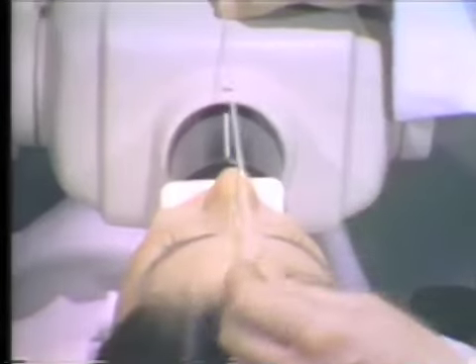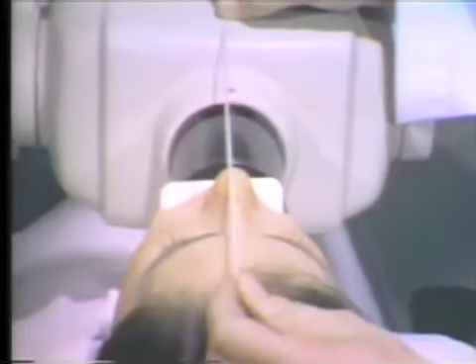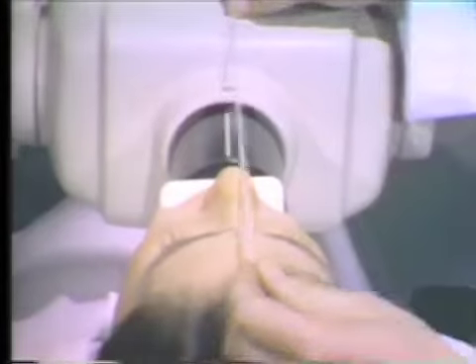With this accomplished, the machine is repositioned so that the central ray will pass along the mid-sagittal plane at a point opposite the first molar area. A taut string may be used to check the position if desired. Viewing from above the patient's head, we are able to ascertain that the central ray is aligned along the mid-sagittal plane of the patient's head. The exposure is then made, and the machine may be moved away. The film is carefully retrieved, and the patient is ready for dismissal.